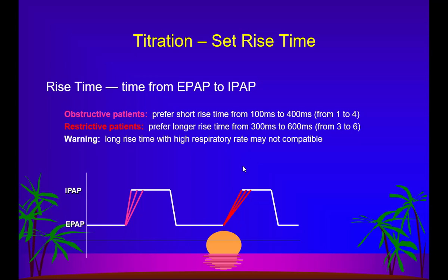And these things become very, very important, especially in case of COPD, because they are breathing hard, they want volume quickly. So in patients of COPD, you set a lesser rise time. You want the machine to convert trigger from EPAP to IPAP very, very quickly, because the patient needs volume, needs more pressure support. It may not be so important in patients with restrictive lung disease, like your ARDS patients or congestive heart patients, because they are already breathing very hard. So in those cases, it may not be very important.